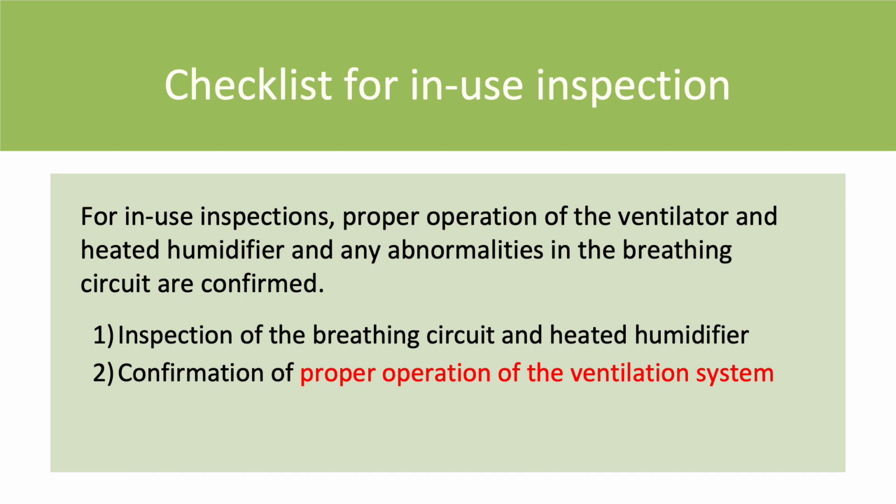In-use inspections are performed at the bedside while a ventilator is being used on a patient. In-use inspection items include checking proper operation of the ventilator and heated humidifier according to the pre-configured settings, and that there are no malfunctions in the breathing circuit. We will describe the inspection of a breathing circuit, heated humidifier and ventilation operation.